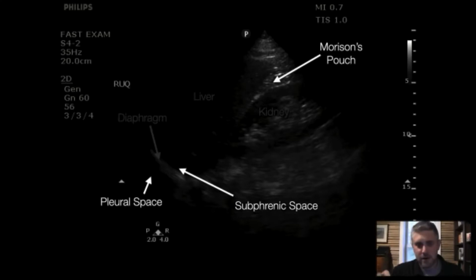You look for landmarks, so when we take off at Hopkins, okay, where's the lake, right? That's the big one. It's a big landmark. You can't miss it, right? If you're on the right side of the plane, you can see that. Okay, there's the lake, right? Where's the city? Okay, there's the city. Now, where's my house? If I know where the lake is and I know where the city is, I can triangulate to find my house. And the same thing with ultrasound.